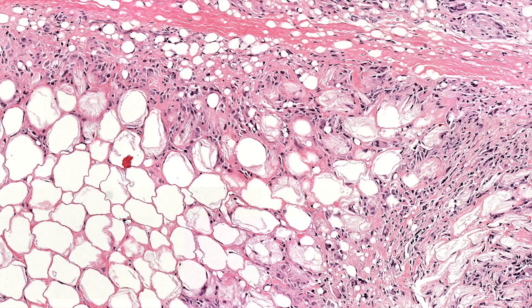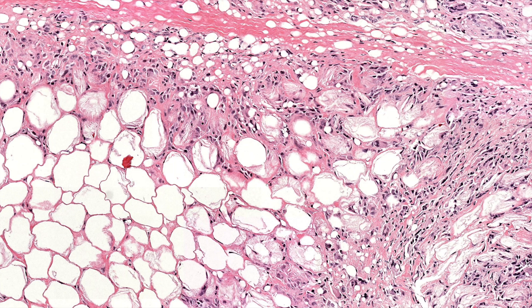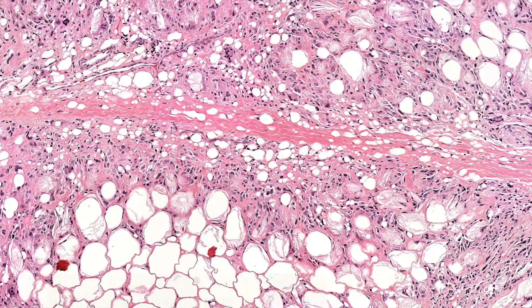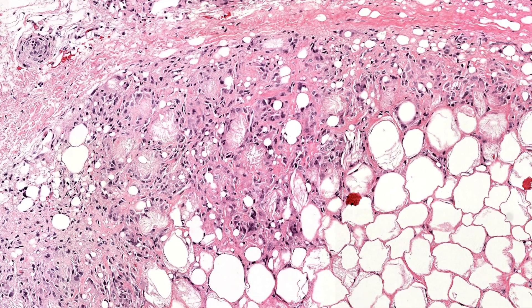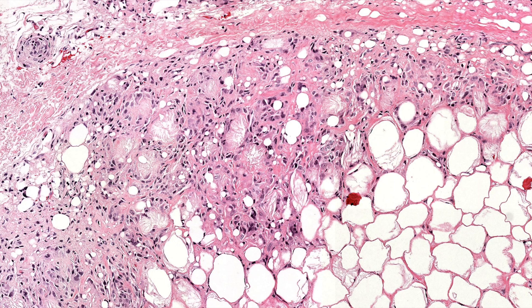Those babies are sick and sometimes do not do well — it can be fatal — whereas subcutaneous fat necrosis of the newborn is more histiocyte-rich with more of these crystals. Clinically, it presents in term infants, maybe after a stressful birth, and can present a little bit after birth as well.